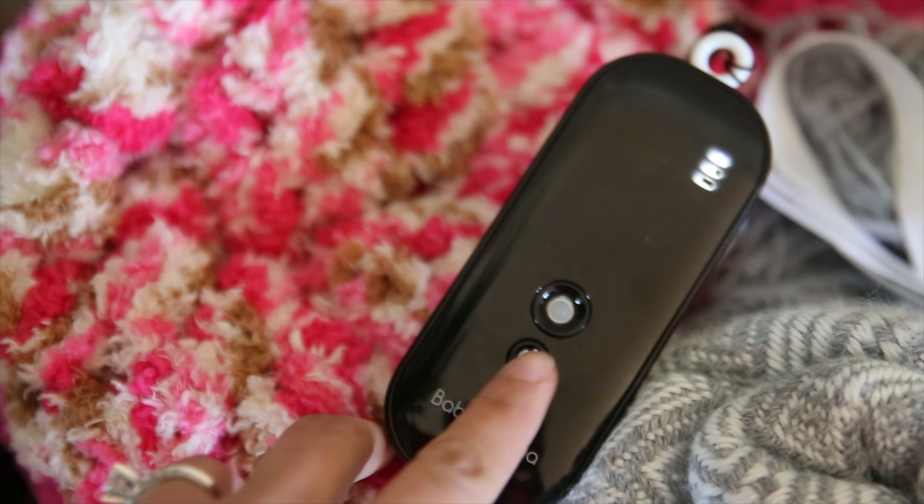Then you can start the pumping session by touching the start button. Like most pumps, it will automatically begin in the stimulation phase, but because of its unique pattern, it is highly recommended that you immediately switch to the expression mode first, even though it's backwards.